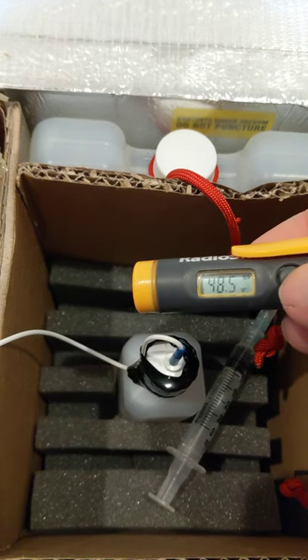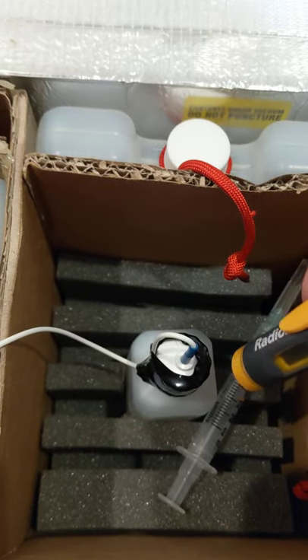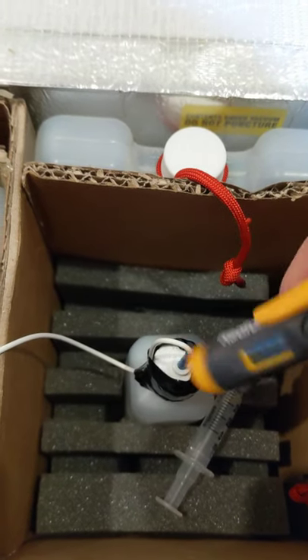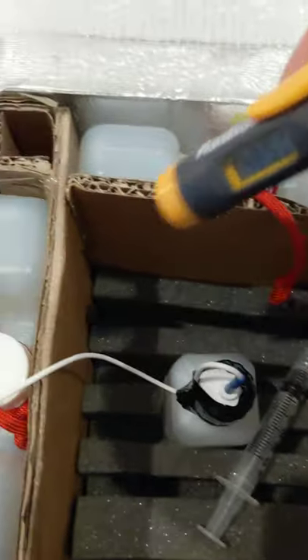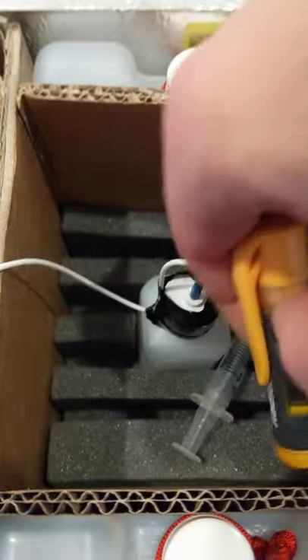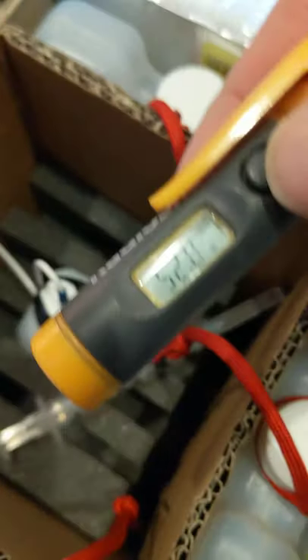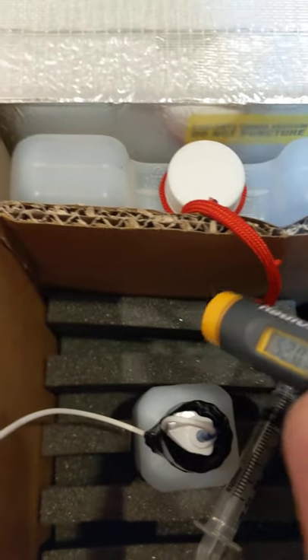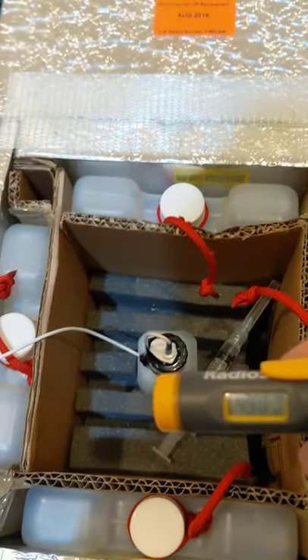The vaccine bottle in the interior of the foam is running at 49, 47, 49 degrees. The walls are 50, 49, 52, and 49, so the temperature is pretty evenly distributed throughout the chamber.